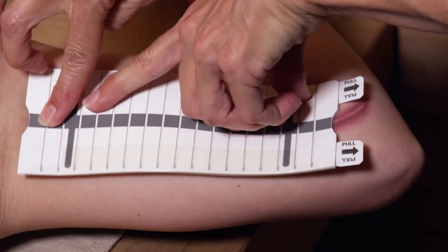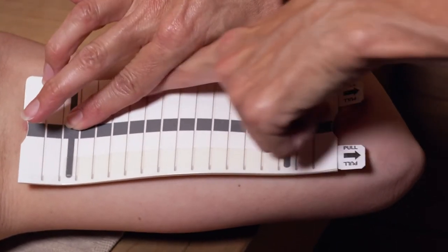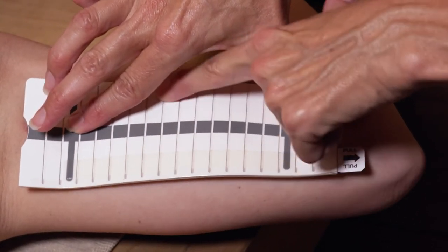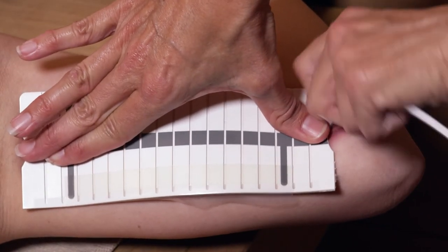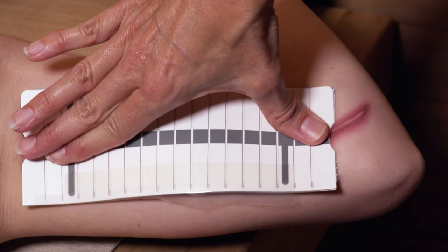Press and hold the dressing on the skin and rub each of the vertical bands on the applicator. Place your fingers along the center dark stripe and pull each tab to release the dressing from the applicator.